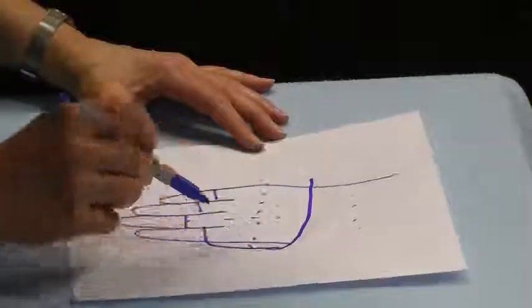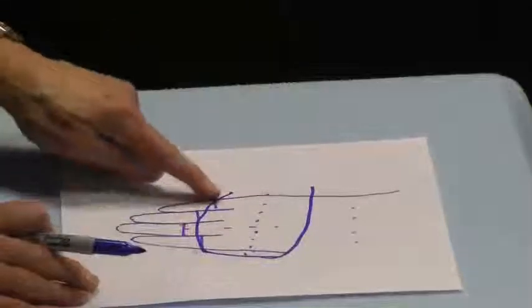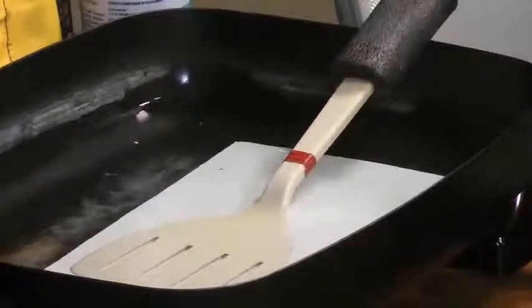I'm taking splinting material and doing this because the blocking is not important. The single greatest problem is not heating the polyform adequately.